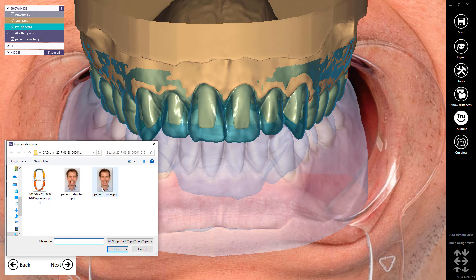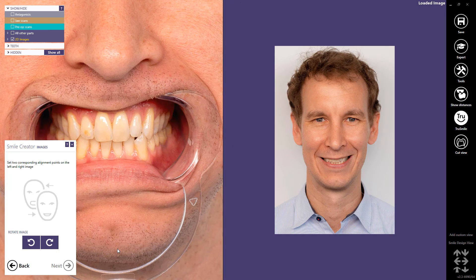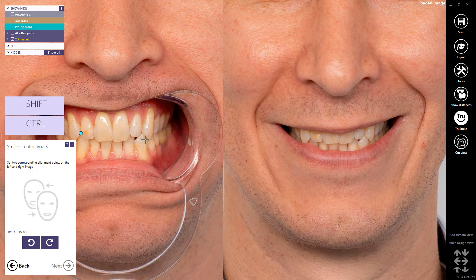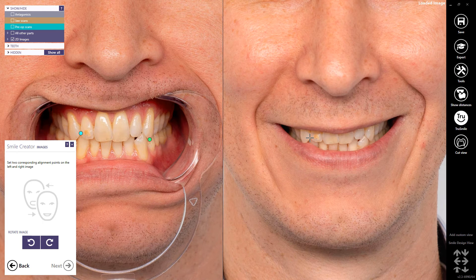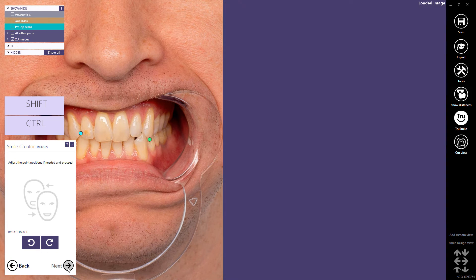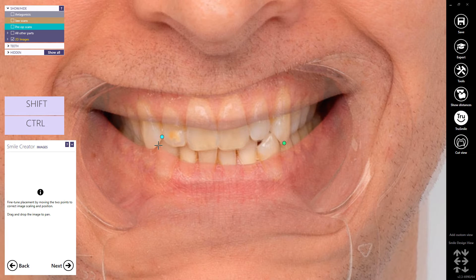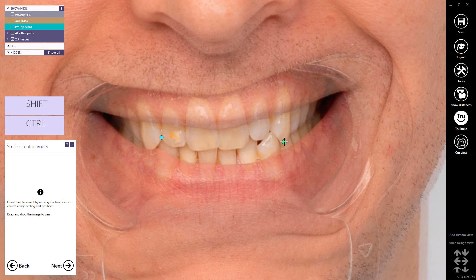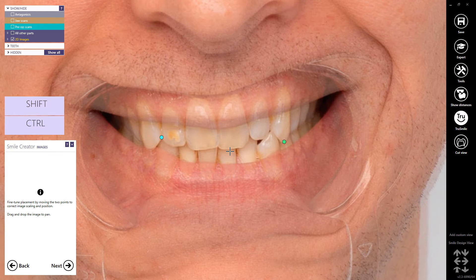Load the smile image. In the second step, we will match the converted 2D images. Set two corresponding alignment points on each of the left and right images. Proceed to Next. Fine-tune the placement by moving the two points to correct image scaling and position. Drag and drop the image to pan. Proceed to Next.